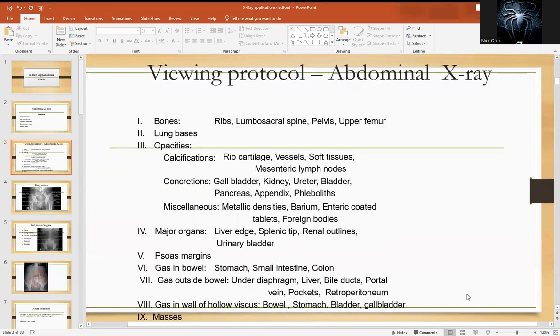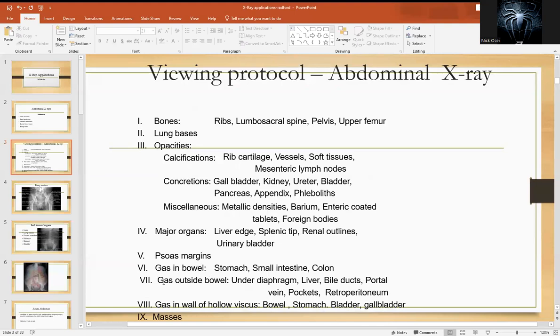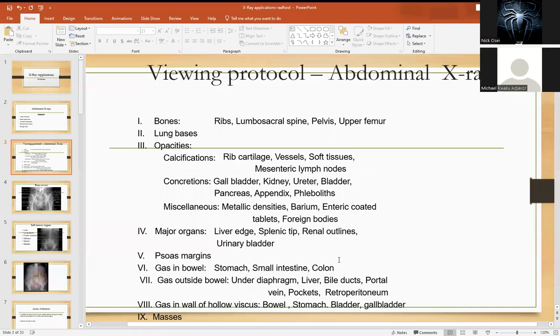If you have an abdominal X-ray, this is just a simple scheme for going through so as not to miss anything. You look at the bones, the ribs, the sacrum and spine — these are the main things that are visible on the X-ray. You start from there, look at the soft tissues, and look out for calcifications, which relate to the major organs in the abdomen. Importantly, you look out for gas patterns in the bowel, and also look out for any abnormal masses that will show up on the X-ray.